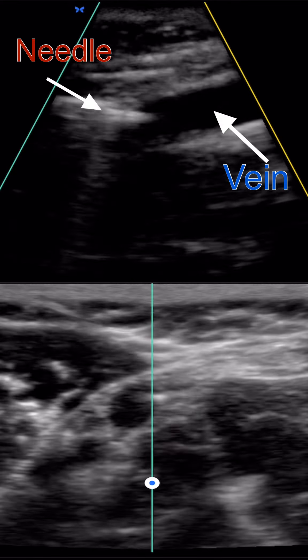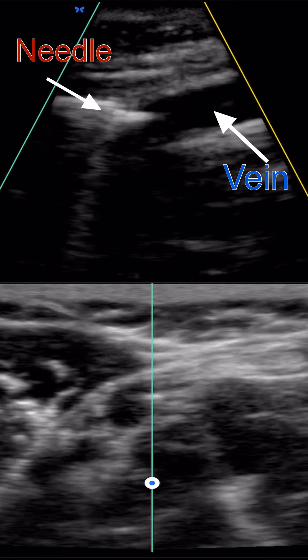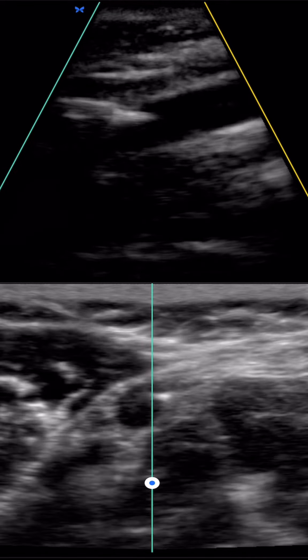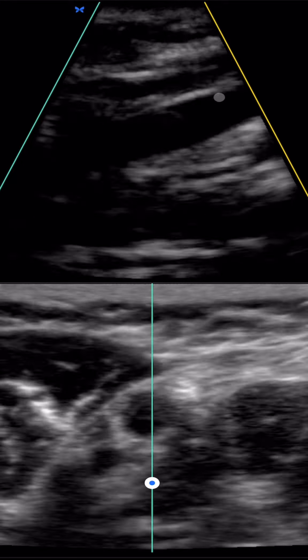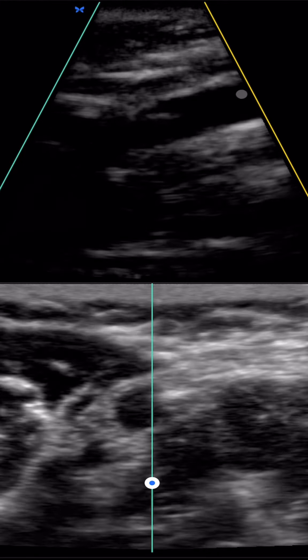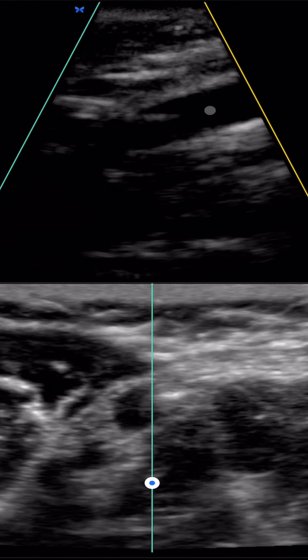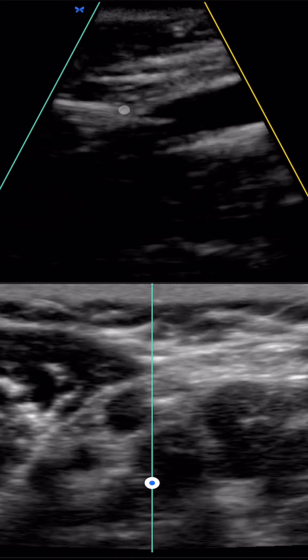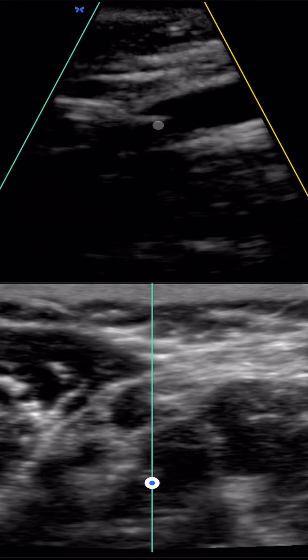Do you see that top view? Do you see that? That's my needle. Do you see that black tunnel it's in front of? Let me see if I can point it out. Do you see this? All that black is her vessel. This is fascia — this is fascia, it's just tissue. Needle is right here. And this is her vein.